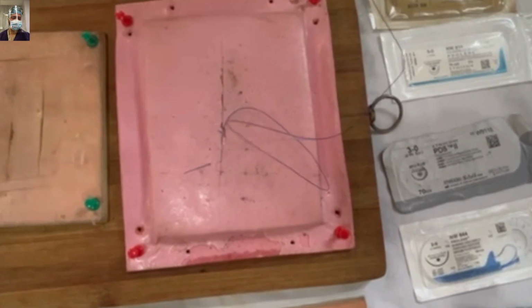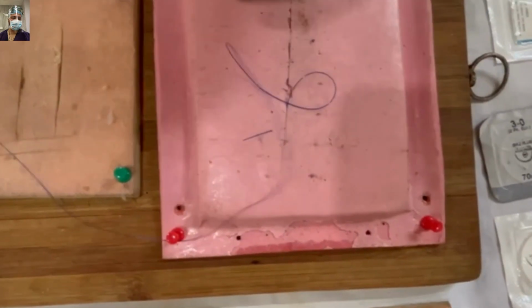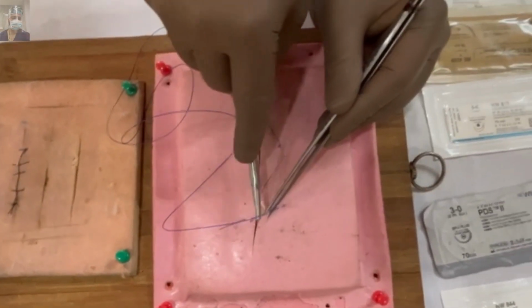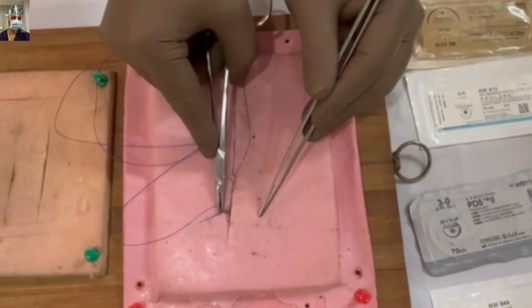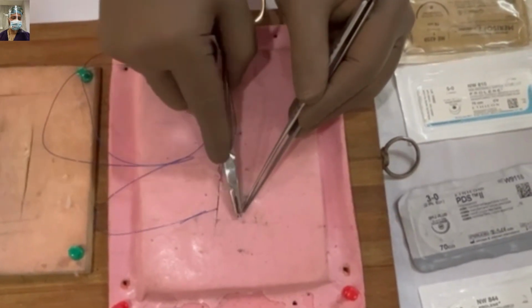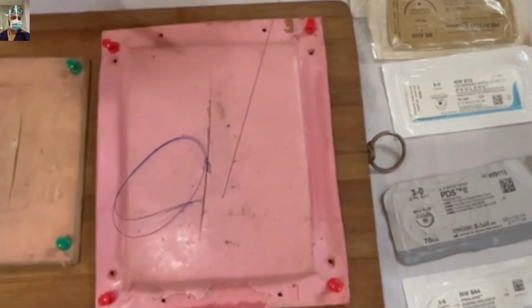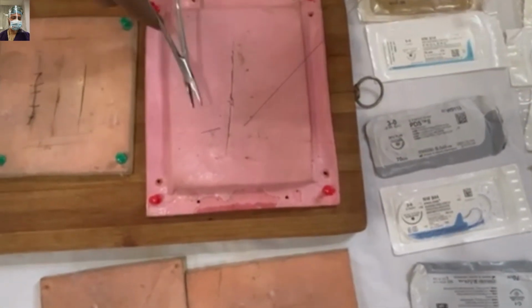Stay in the same plane on both sides, and the entry and exit point should be in the same plane. Again, if you notice, I am not touching the needle with my hands, and all these needle transfers are done with the help of instruments only. So you have to practice these maneuvers, and please apply at least 100 to 200 stitches the same way I have demonstrated, so that you master it.